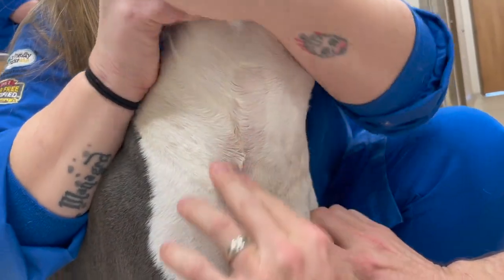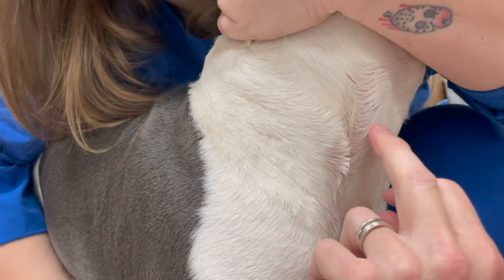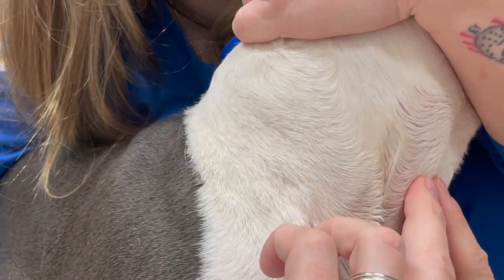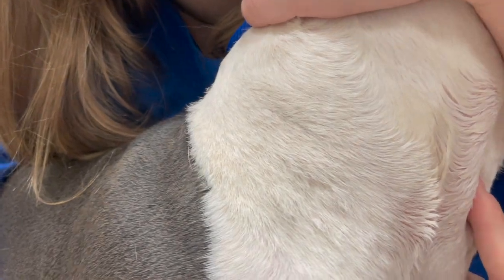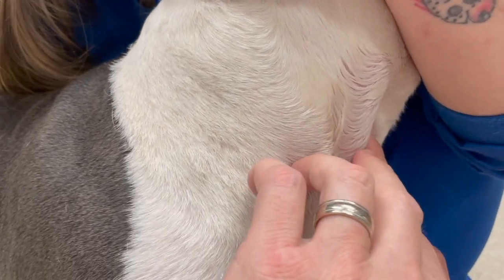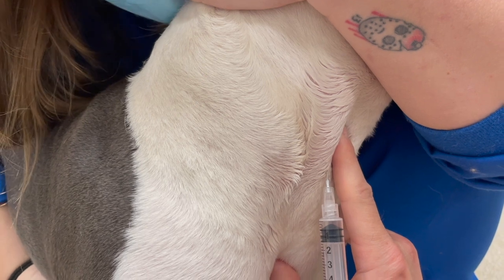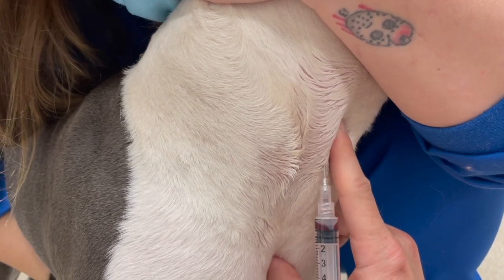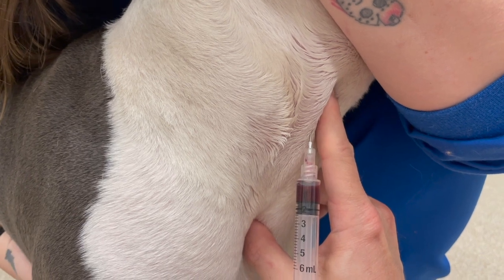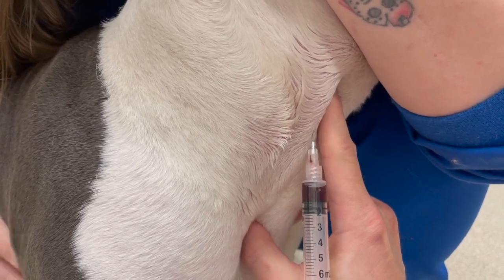You're a good girl — I know it's cold. Sometimes it's even hard for me to see it. I'll lay my finger right beside it — I know it's right there, you can feel it right along through there, so I'm stabilizing with my finger. I get my needle ready and I'll go through the skin and into the vein with a nice smooth, firm, confident stroke. It didn't go all the way into the vein but I'm under the skin. I went through the vein, so it just had to be repositioned. I'm going to lock my two hands together and apply gentle pressure — just enough suction to allow the blood to flow.